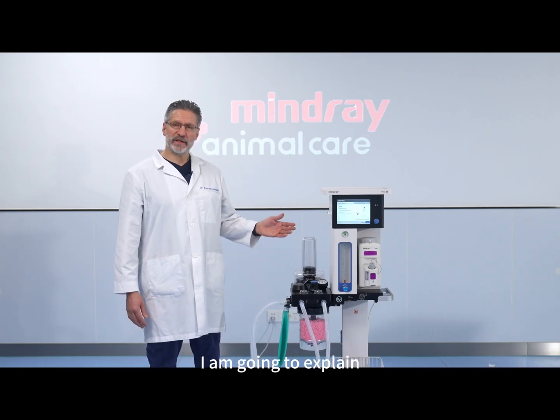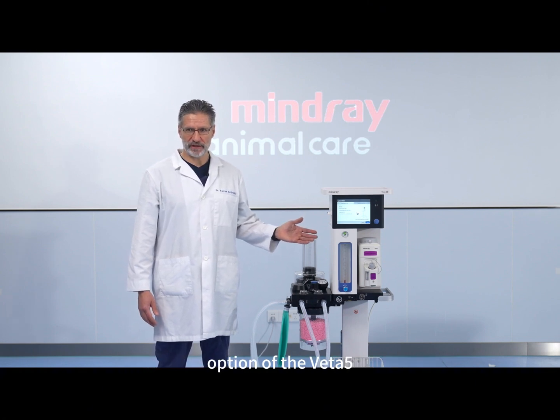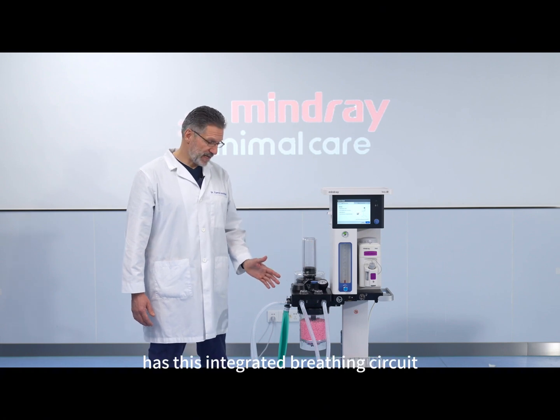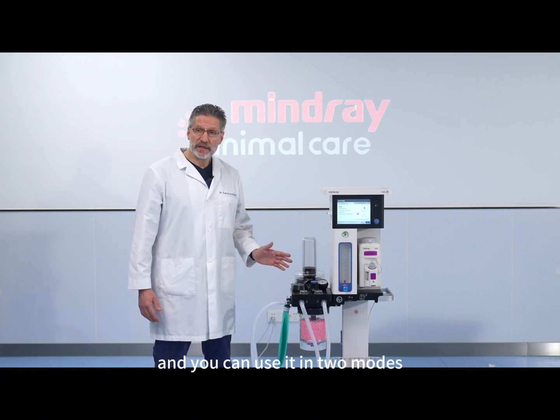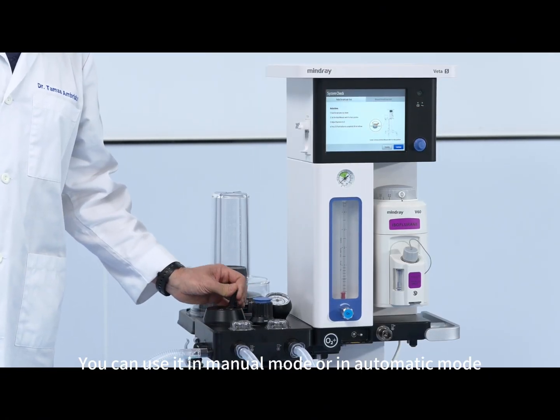In this video I'm going to explain how to use the automatic pressure testing option of the VETA 5. The VETA 5 has an integrated breathing circuit and you can use it in two modes: manual mode or automatic mode.